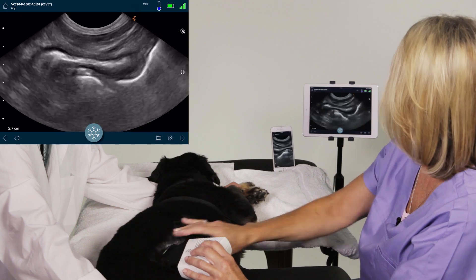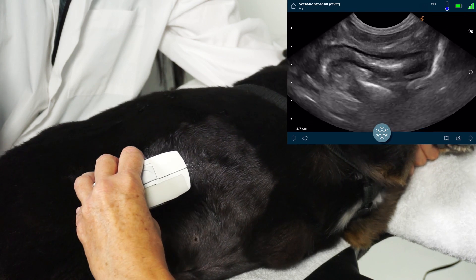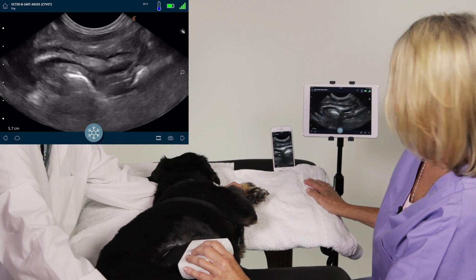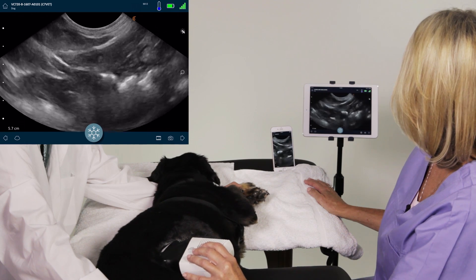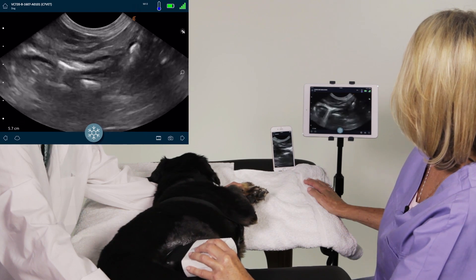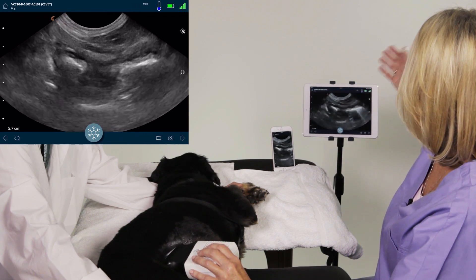So I'm going to go longitudinal or sagittal. My light is facing the dog's head, and right here we're looking at a section of bowel, which is going to be a good area to use the scanner in. So I can rock or fan through the image, so I'm going out of it just like it was its own organ. You want to always go in and out of the whole area that you're looking at. And then I'm actually going to turn this around now — again, very easy to do.